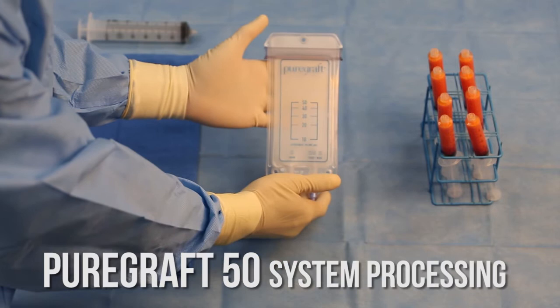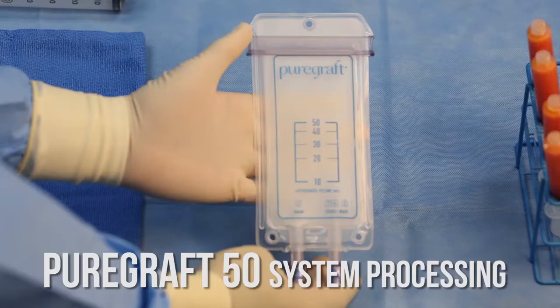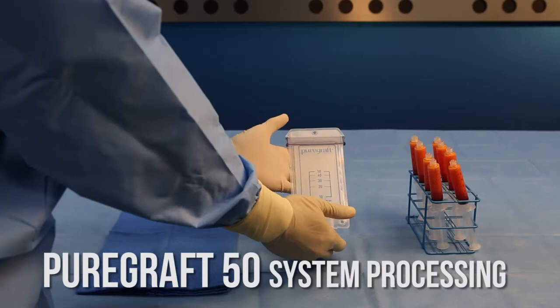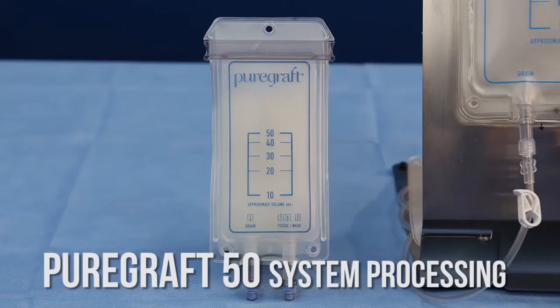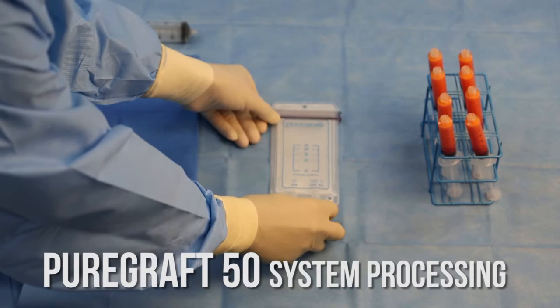With advanced filtering capabilities, the PureGraft system selectively washes the tissue and drains the fluids, free lipids, blood cells, and other contaminants in less than 10 minutes, streamlining the graft preparation process. The PureGraft system is easy to operate, allowing autologous graft preparation within a closed system and can be performed on the sterile field without the need for any mechanical equipment such as a centrifuge.